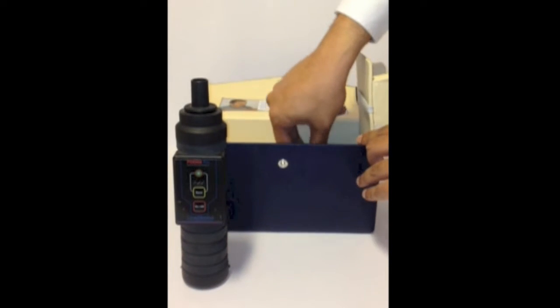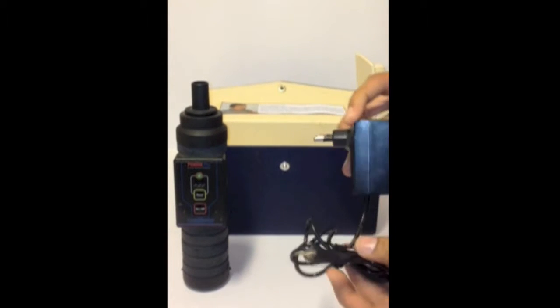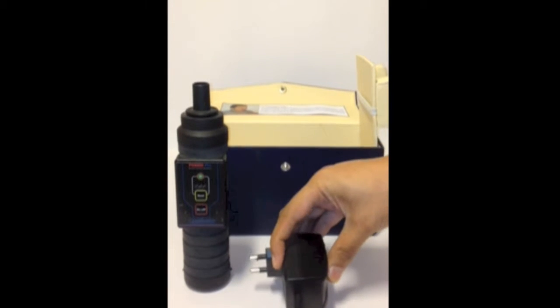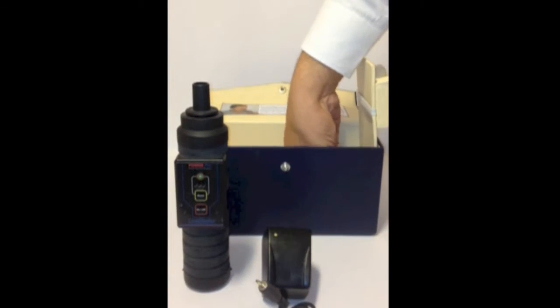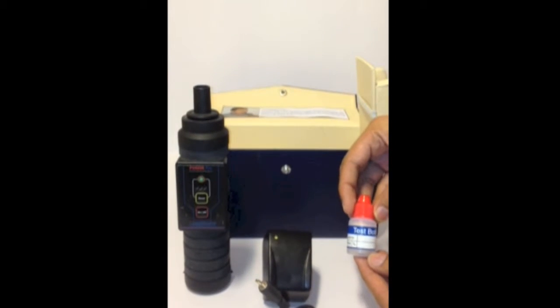It also contains a compact battery charger for charging the instrument. This charger needs to be plugged into 230V and the socket needs to be plugged into the instrument. The last content is a small test bottle which is required to test the operation of the PD6000 Pro instrument.